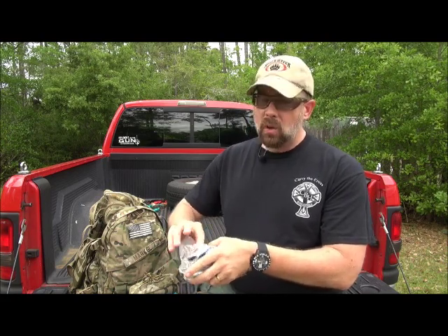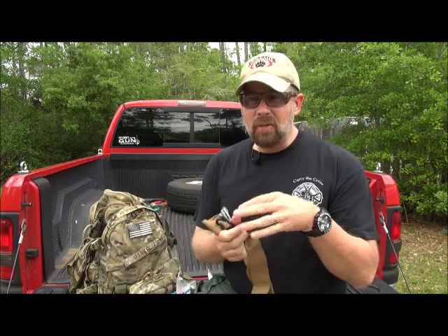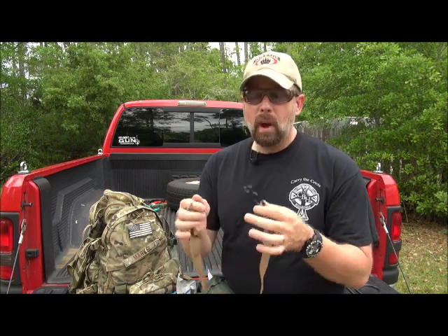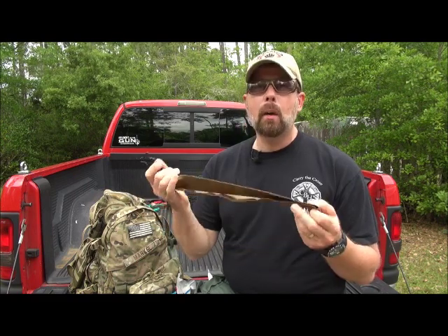First and foremost, if you have a major bleed, I've got a TK4 tourniquet. Now, if you know me, you know that I don't really like the TK4. The TK4 is not my first choice in tourniquets. There's several reasons why that is. But the TK4 is lightweight, it's inexpensive, and it's compact.